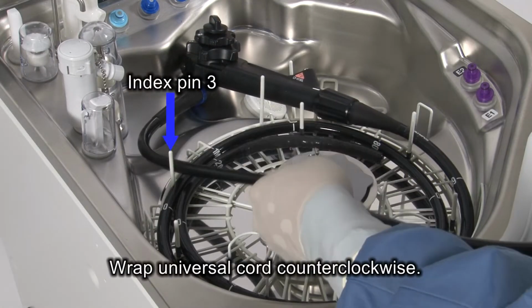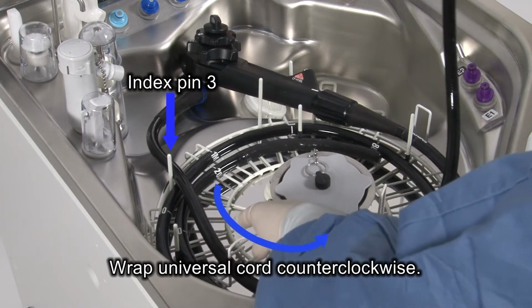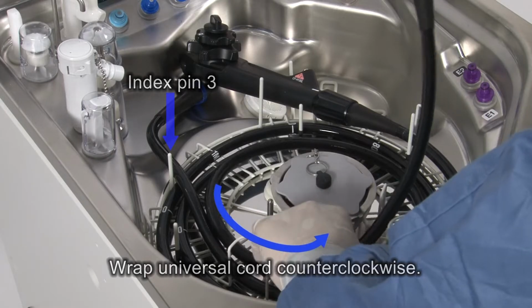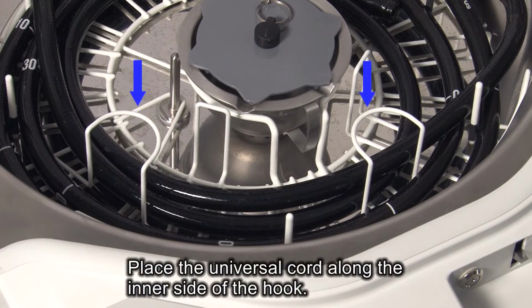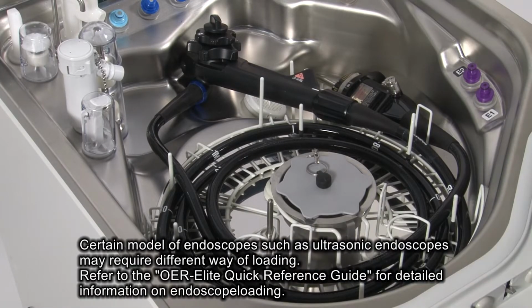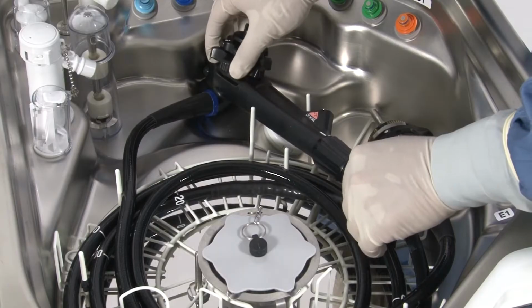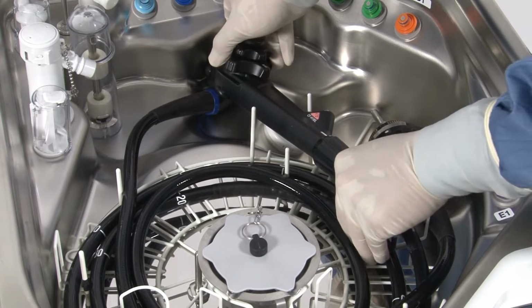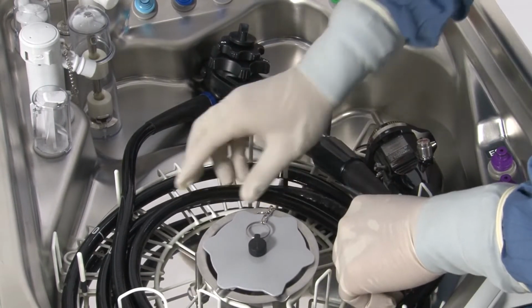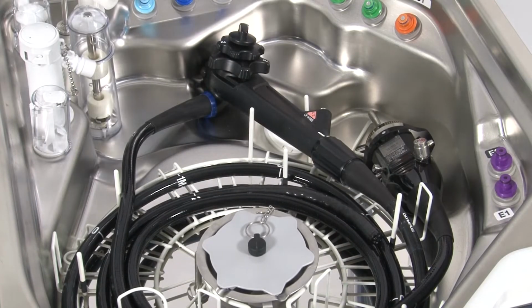Wrap the universal cord counterclockwise around the inside section of the retaining rack. Place the universal cord under the hook of the retaining rack. Place the endoscope connector above the drain port. Adjust the positions of the insertion tube and universal cord to minimize overlapping. Position the scope ID tag right below the boot to avoid overlapping.